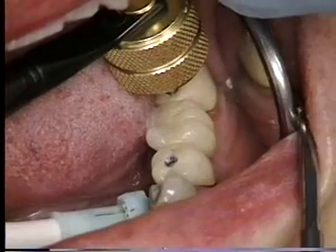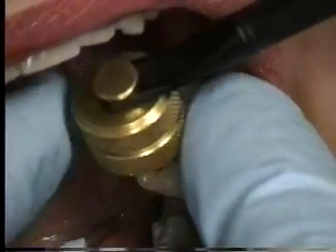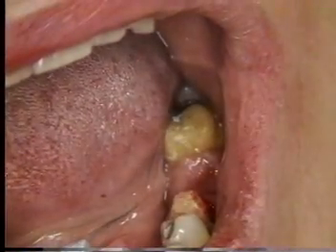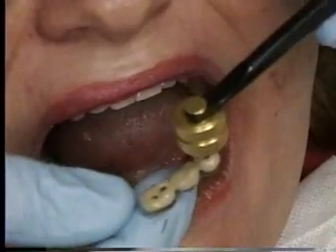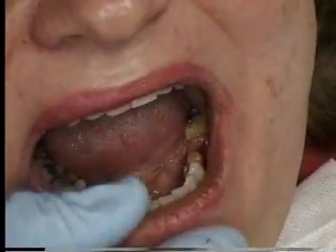You can see there on the back where the molar is being lifted up. Making sure this is threading through now — and there's the bridge that came right out of there. There's the bridge; I lifted it right out of there.